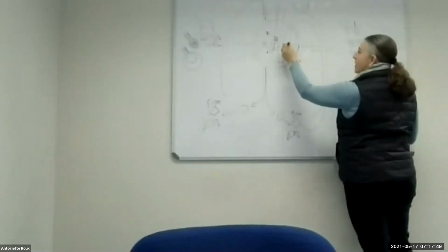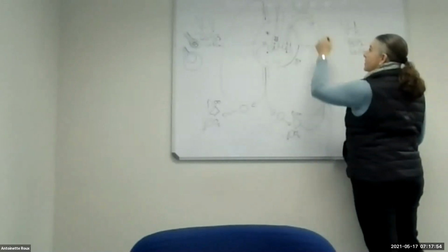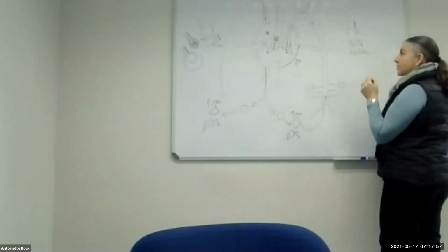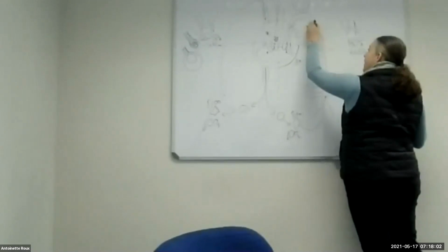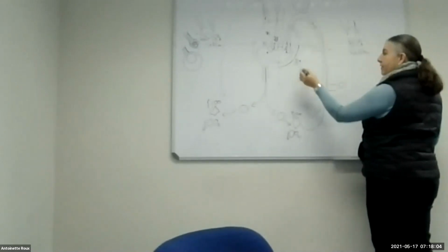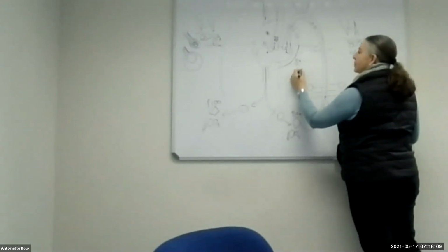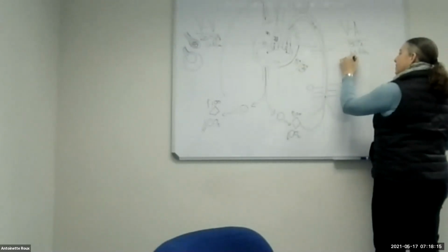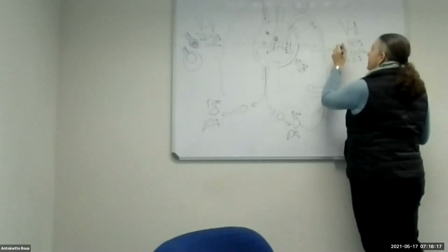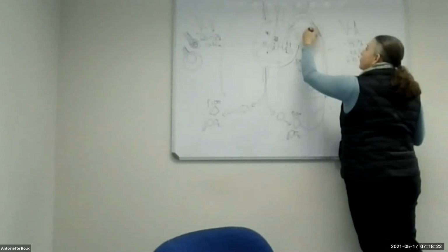So if you've done your ejection fraction, it means on the VA ECMO side, you're only ejecting 20% of the blood into the system. So the rest of your organs doesn't get enough oxygen. So from the ECMO perspective, we have supported the patient the other 80% initially when it was bad. And tomorrow, I can then see, oh, but my ejection fraction has improved to 30%. So then I can come down to 70%. If I carry on with the 80, it means the heart is going to get better to the 30%, and I'm going to be having overshooting here.